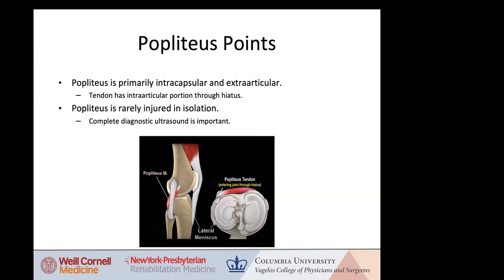You highlighted a couple of things, but one of the first things that you said in the presentation was knowing where something starts and where it ends, and having that foundation of anatomy. I think that's something that I at least personally emphasize with all of our residents and fellows: unless you know the anatomy, you're going to have a really hard time doing ultrasound, because you can't just throw the transducer on someone's skin and say, I'm just going to find what I want to find.